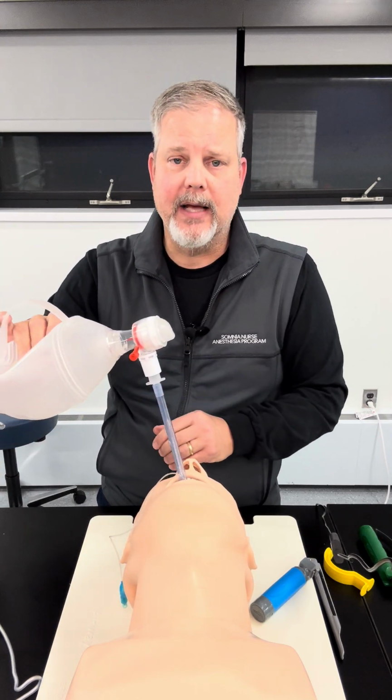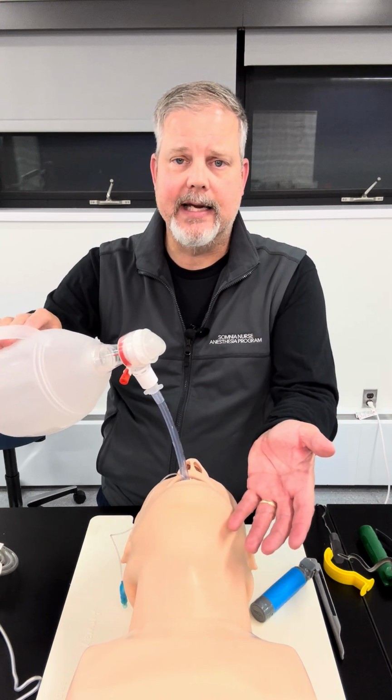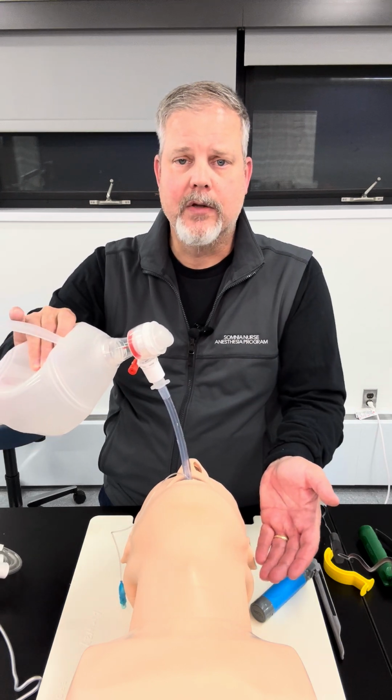And then I'm going to connect my reservoir bag and connect my circuit up and squeeze my reservoir bag to make sure I am moving air. And I can see the lungs inflating here and rising. So I know that I've now put my endotracheal tube in successfully through this technique.